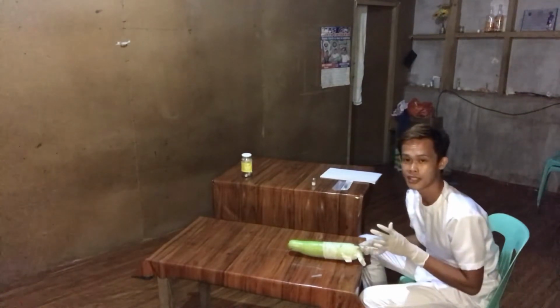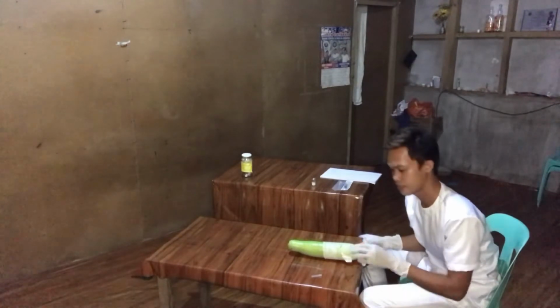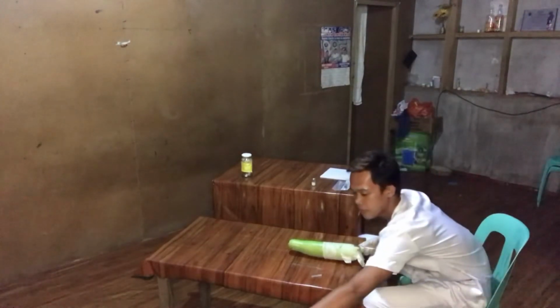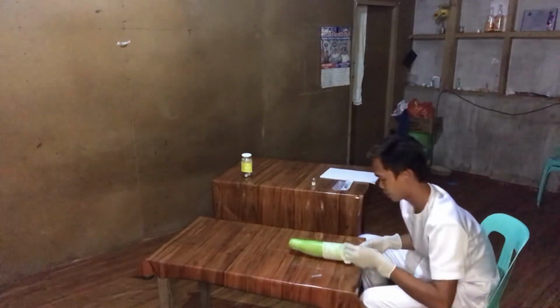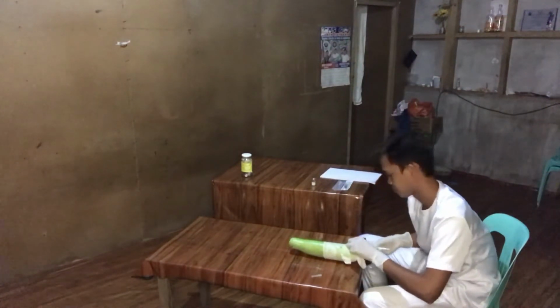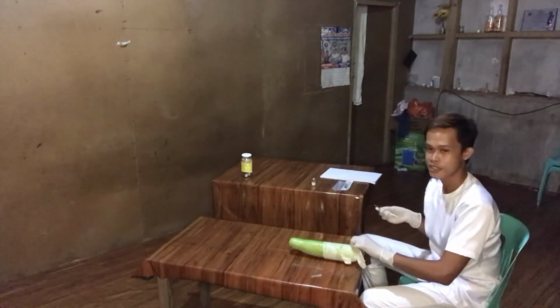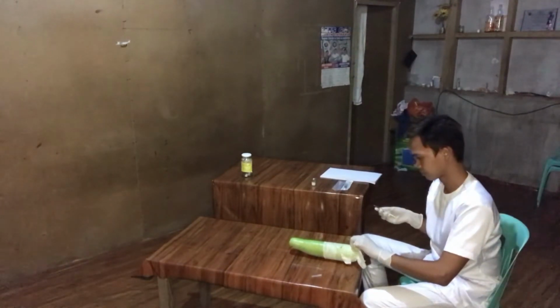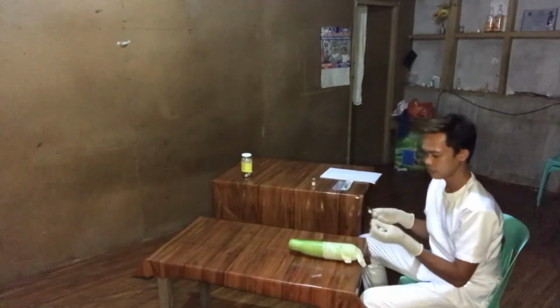Now we remove the needle at the same angle to minimize tissue damage and discomfort. At the same time, we are going to put the cotton balls. Pat dry with cotton balls and do not massage the area. So all is well.